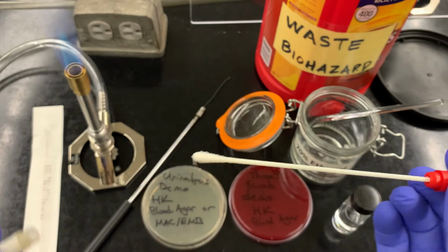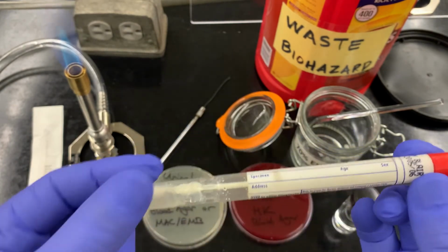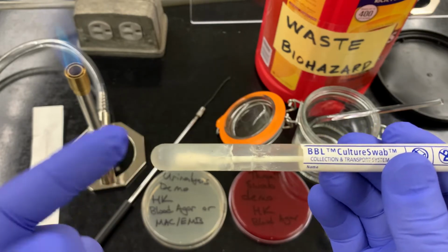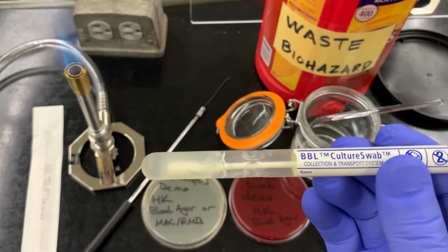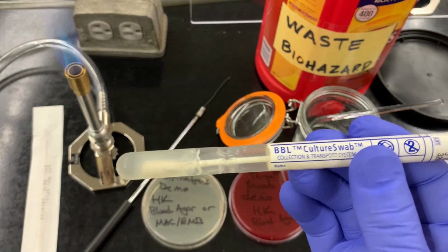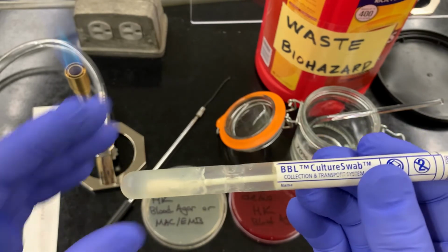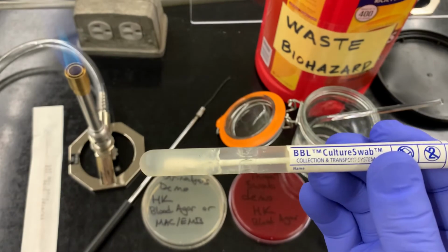When you open this up, you got yourself your nice sterile swab. This is kind of old, but it is a sterile swab. And then we have this gel-like, agar-like substance on the bottom here. And this does a couple of things. First of all, it provides a nice moist environment. It prevents bacteria from drying out, so the sample that you get is not lost over time as we transport it. It also has bacteriostatic ingredients in here to prevent microbes from growing. So once again, we're not going to overgrow whatever we get from your sample. So this, hopefully, keeps things as most representative of the sample as possible.